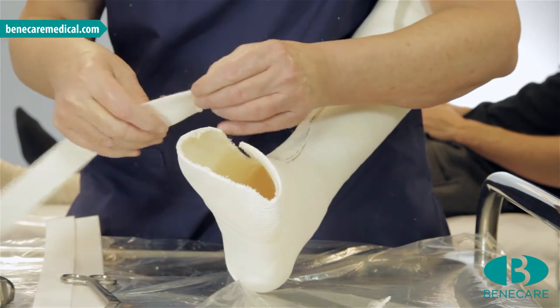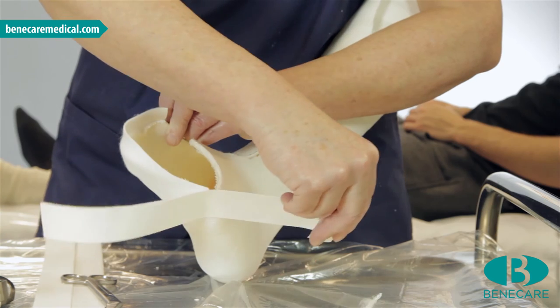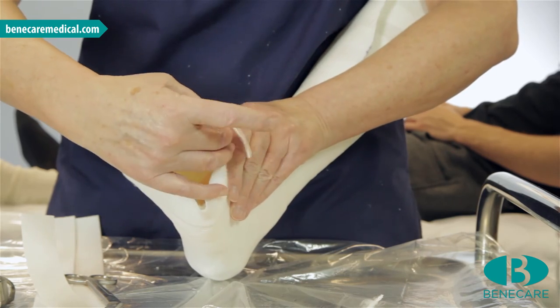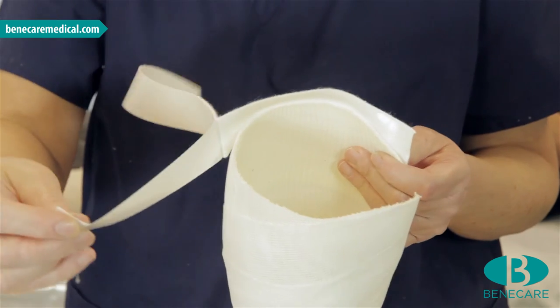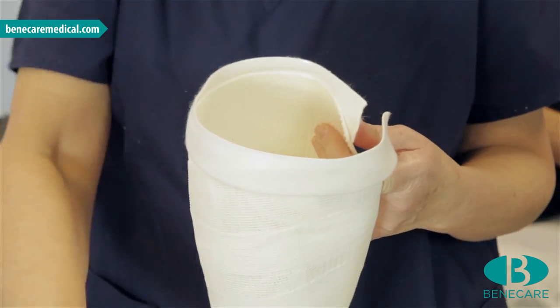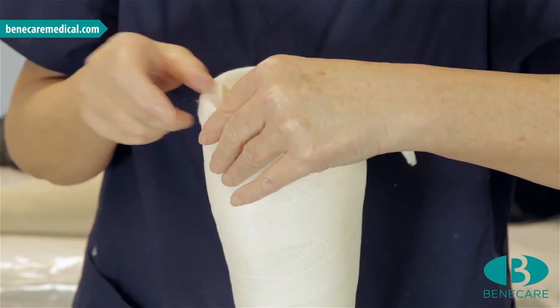Trim the cast at both extremities. Following the anatomical guidelines, I am trimming this back to expose the little toe. I am now applying fleecy edging tape — I will start with the distal aspect, now the proximal — ensuring this is smooth with no ridges on the inside of the cast. I will continue along the anterior border of the cast, again ensuring it is smooth throughout.